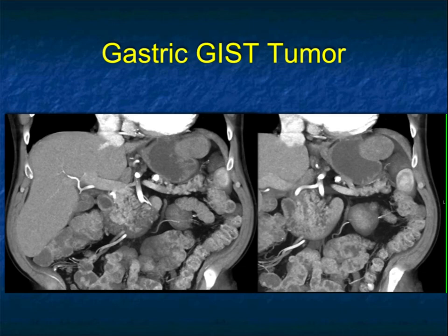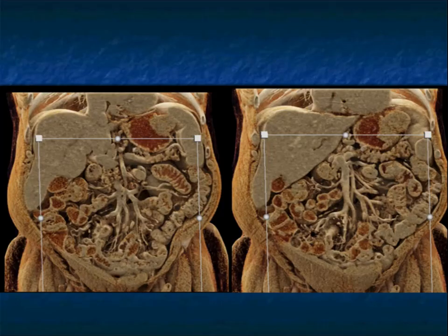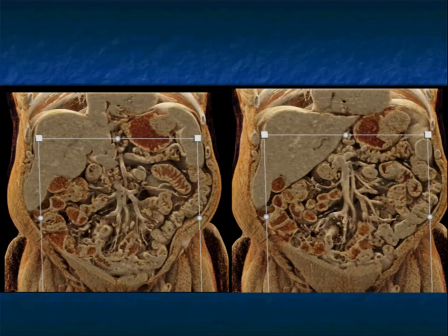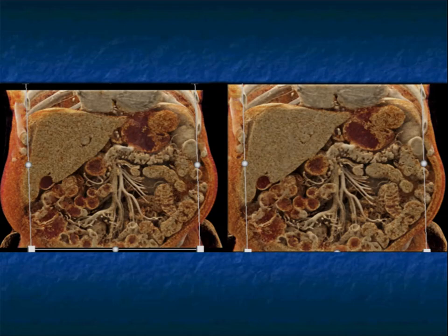Another example: a mass coming off the region of the greater curvature, really high up — very nice appearance. Here is the cinematic rendering; I have been looking at cinematic rendering with texture mapping in GIST tumors. You can see the homogeneous enhancement, and when I change the texture, you can see the texture of the lesion. We are looking at texture for determining tumor types and potentially predicting outcome.